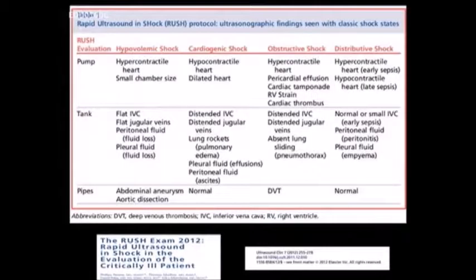The RUSH exam is a three-part examination that begins with evaluation of the pump or cardiac status, continues with part 2, evaluation of the tank, and finishes with part 3, evaluation of the pipes. In this video segment, we're specifically going to focus on part 2, evaluation of the tank.